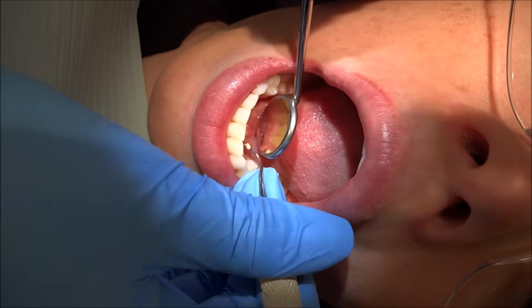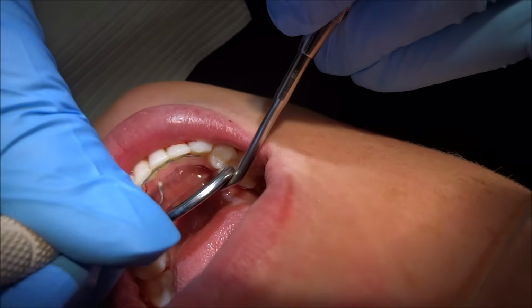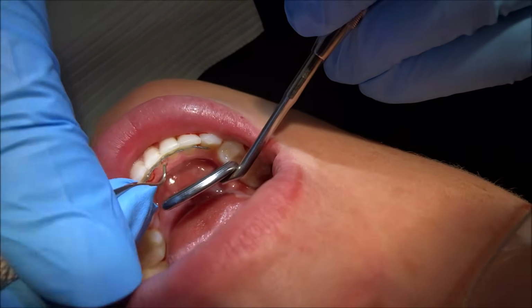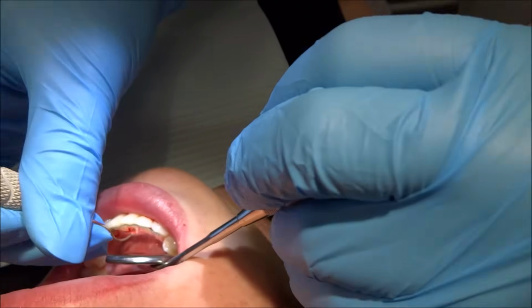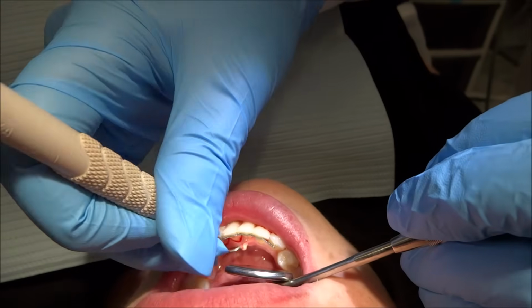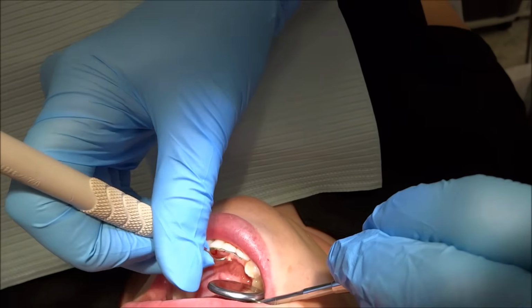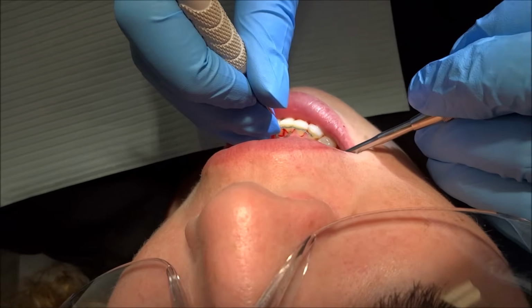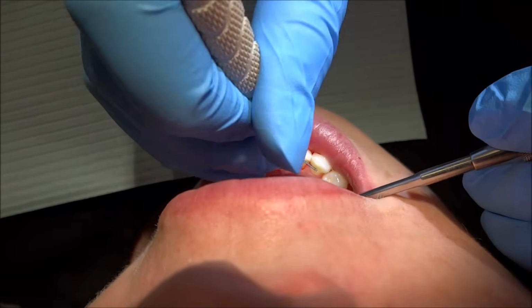She's got a nice lingual bar. What I like to do with lingual bars is just pretend that they're not there and scale everything underneath, just as if your lingual bar was your contact. If you tip your head down just a little bit, Jessica. You can go back and get the fossas.